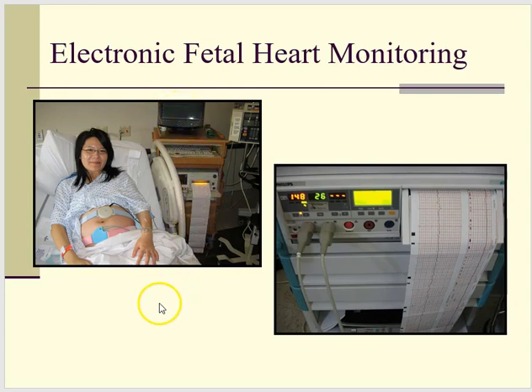The intent of intrapartum fetal surveillance, meaning fetal surveillance during labor, is to assess uterine activity, contractions, to assess the fetal well-being, how your baby is responding to the contractions, and to assess the response to those contractions so that you can make appropriate physiologically based clinical decisions.